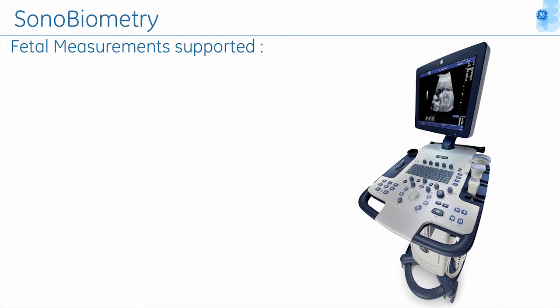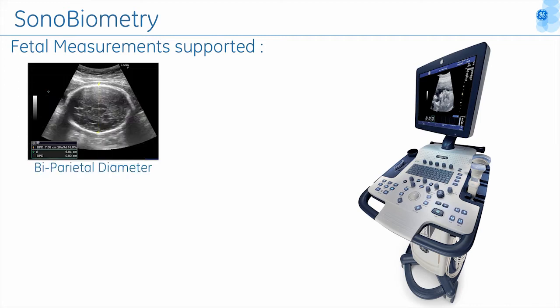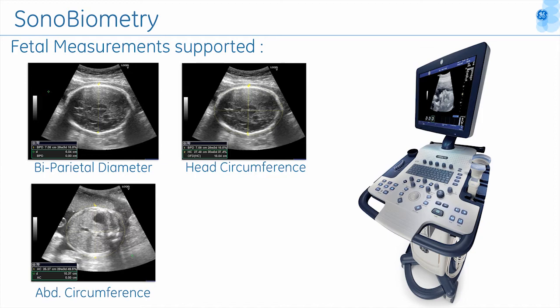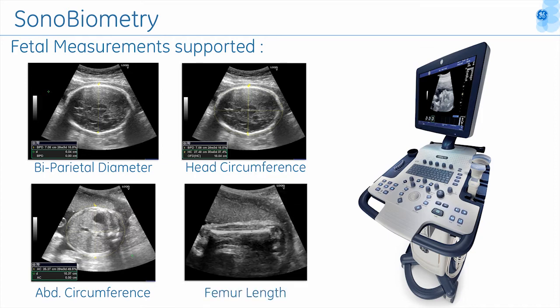Currently, the Sonobiometry algorithm supports automatic measurement of the following fetal measurements: biparietal diameter, head circumference, abdominal circumference, and femur length.